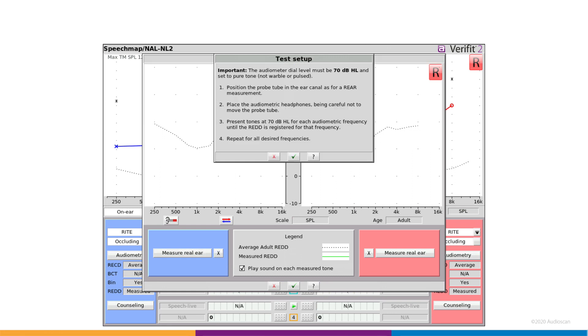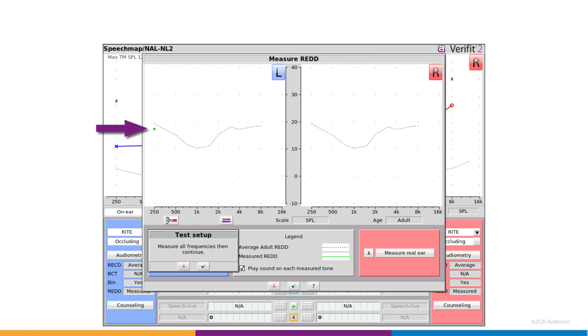Start by clicking on Measure Real Ear for the ear of your choice. Set up the audiometer to present continuous pure tones at 70 dBHL. Position the probe tube in the client's ear. There's a button to launch probe guide from inside the REDD screen to make this part easy.